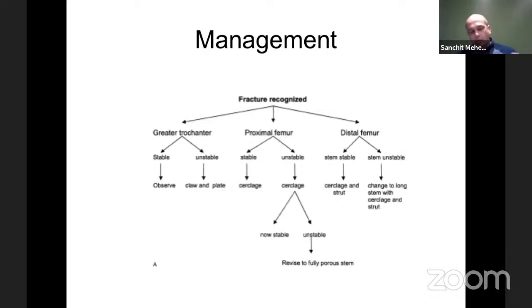So typically, when you're trying to engage an uncemented stem around the lesser trochanter and you get a calcar split, if the prosthesis itself is stable, you can get away with cerclage. If the prosthesis is unstable, you get the cerclage fixation. If now you can restore a tube, then you can go up a size or get a fit in. You could bail out to a cemented stem. Or if the fracture and the prosthesis still remain unstable, then you have to get distal fixation with the fully porous stem.